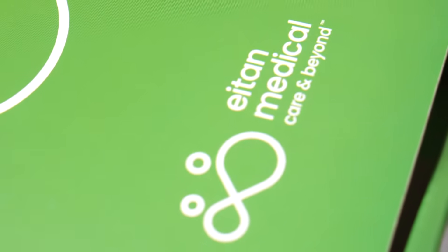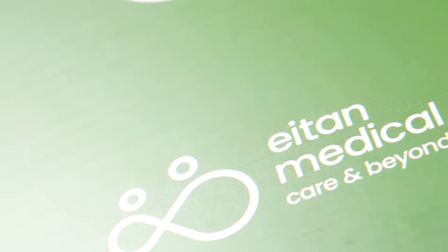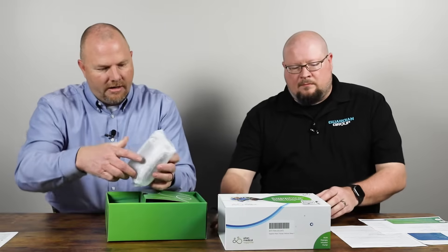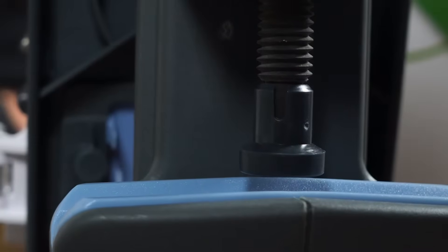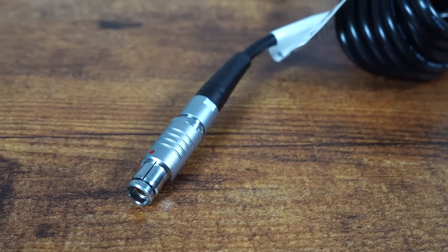So this is the box you will get with a new pump, and we're just going to go through it here and highlight some of the features. These pumps are made in Israel by the manufacturer Eitan Medical, and that is a great group to work with. Inside the box, you've got the pump itself, a cradle for securing the device, and a charging cord.